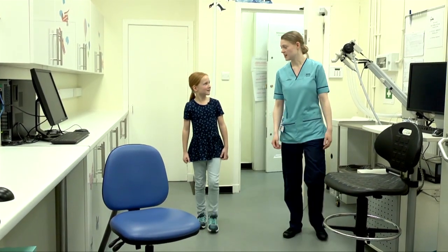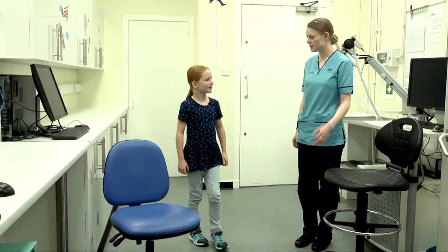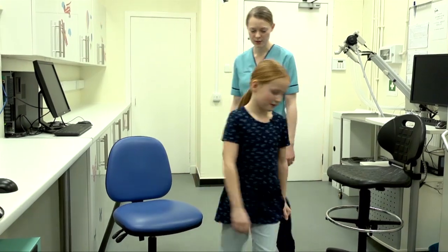Hey Susan, this is where we do our breathing tests. Thank you for letting me film today. That's okay — do you want to have a wee seat and then we can have a chat about what we're going to do today?